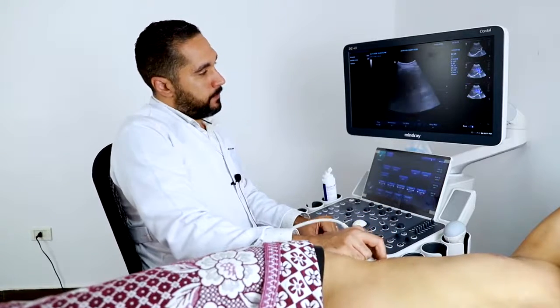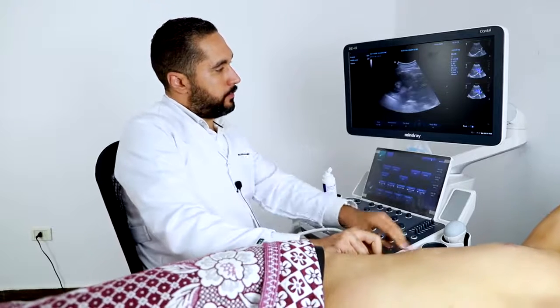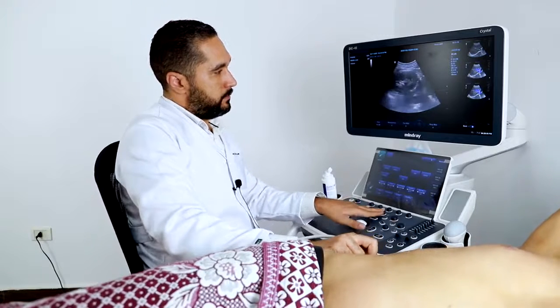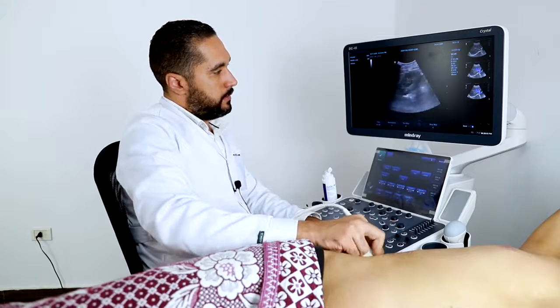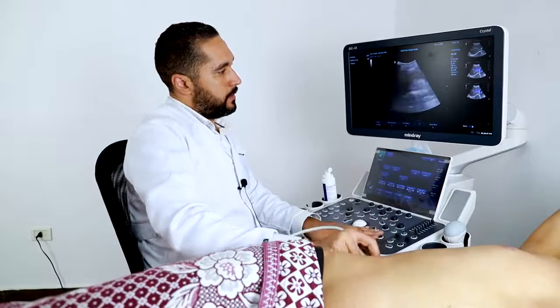After we saw the liver, we're going to see the kidney. Here I'm trying to get a good view. This is the kidney. This is the liver and the kidney.